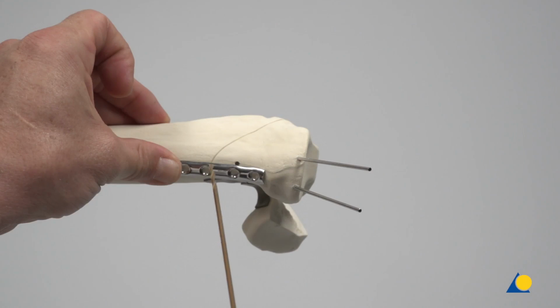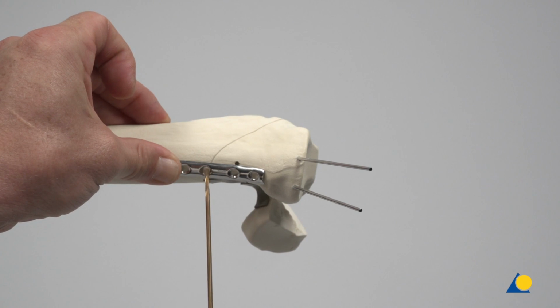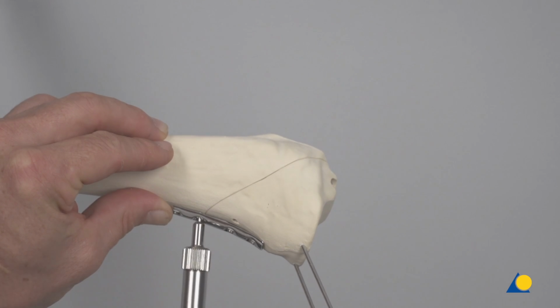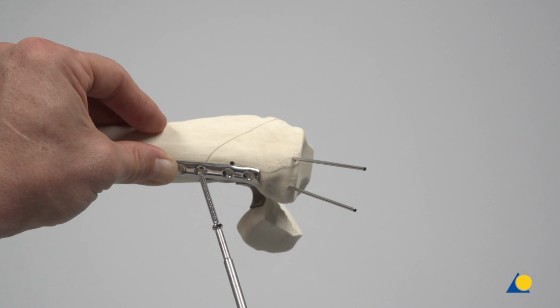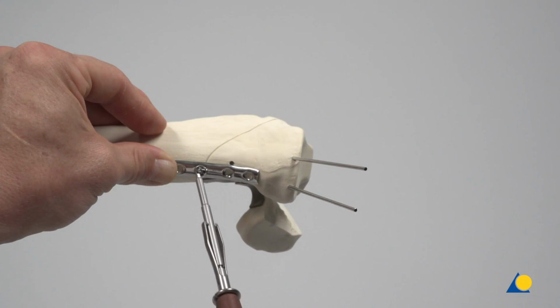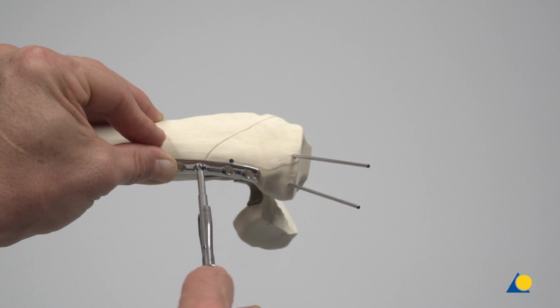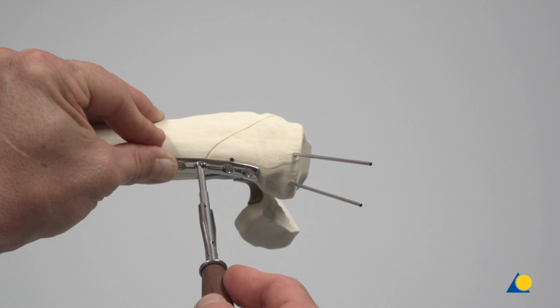A 2.5 mm hole is drilled just distal to the apex of the fracture. The depth is measured. Here, a 48 mm cortex screw is inserted, initially under power with the hexagonal screwdriver shaft and final tightened with the hexagonal screwdriver. This maneuver pulls the plate into its anti-glide or buttress position, thereby reducing the fracture indirectly.